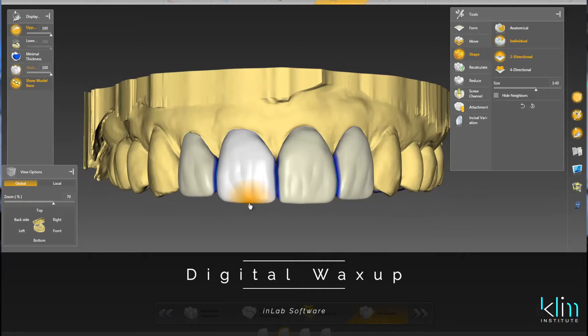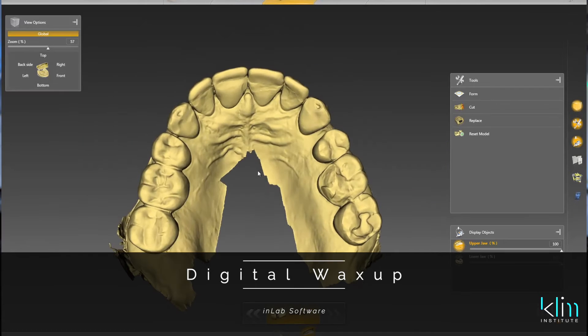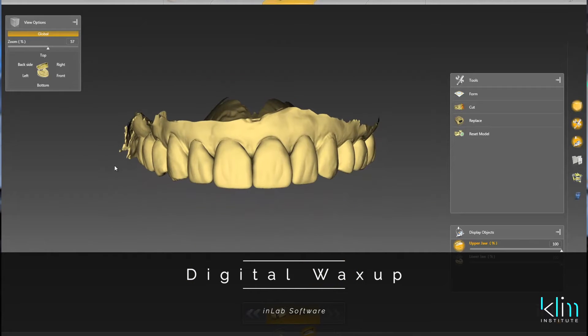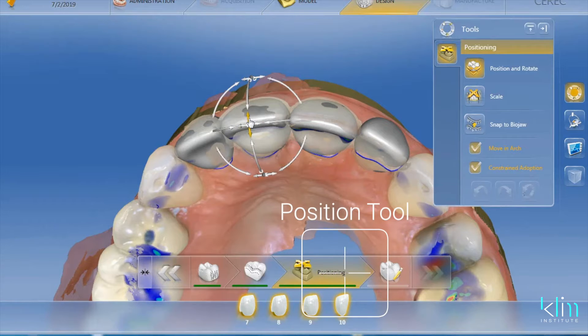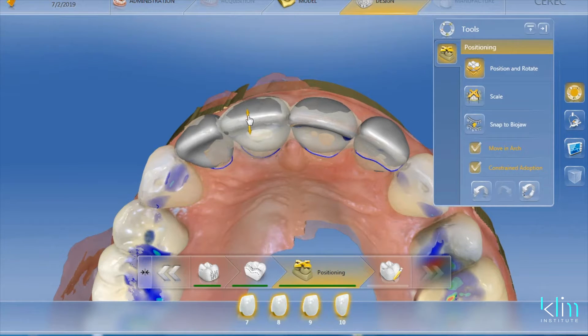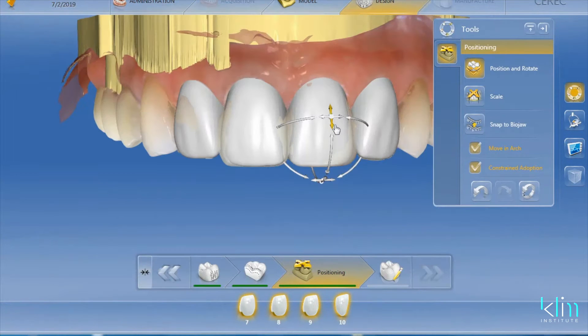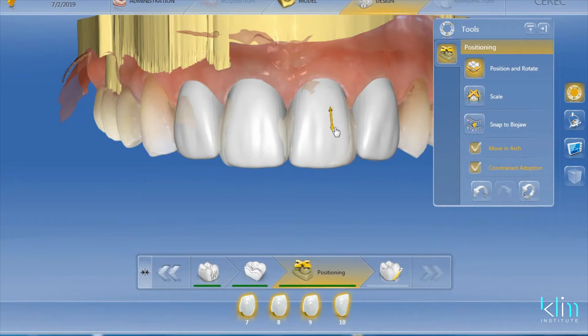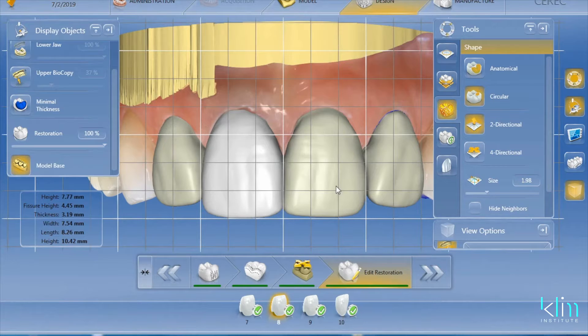It's the same steps that I use for a digital wax-up in-lab. What we do is choose a template and then fit the design process into the biocopy scan. The value I have found using biojaw is that the proposals, the line angles, and the emergence are so much cleaner.